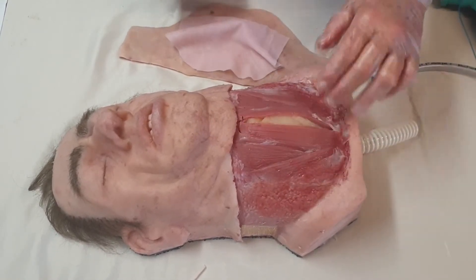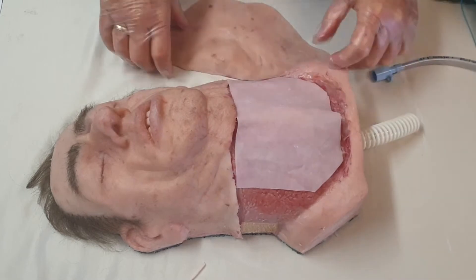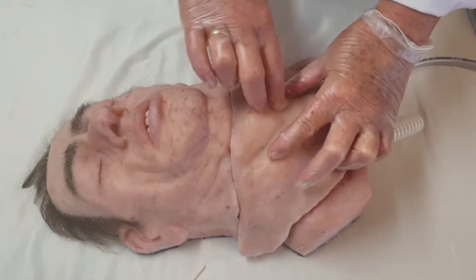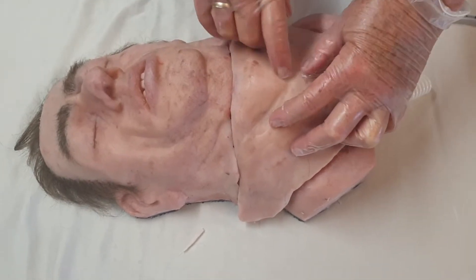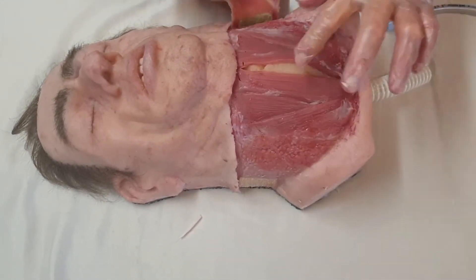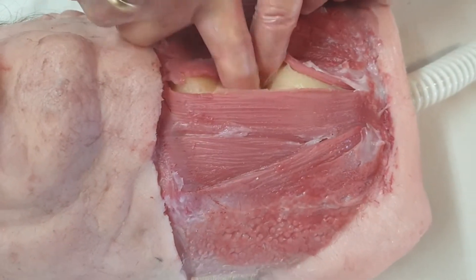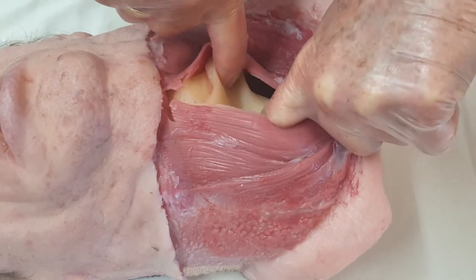The whole idea with this fat neck model is that a person will have to make an incision of around eight to ten centimeters through the neck, like so, open it up, open up the membrane underneath it, then go in between those strap muscles and try to feel where the trachea is.